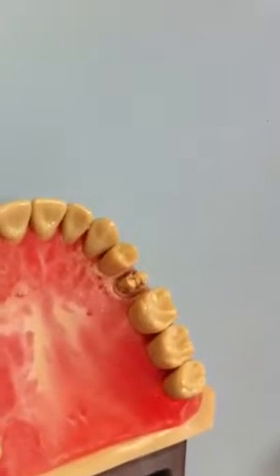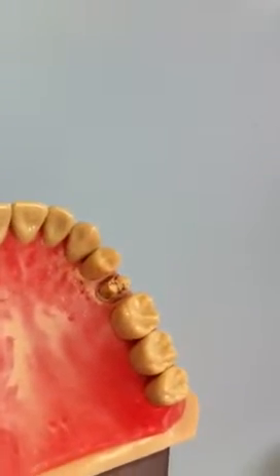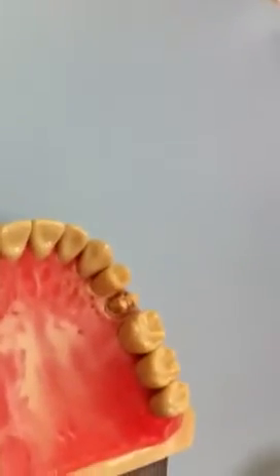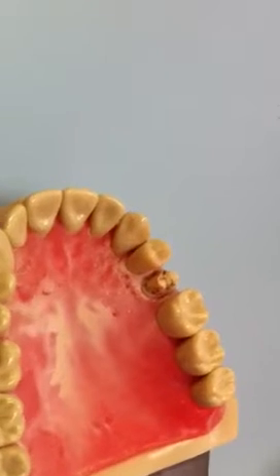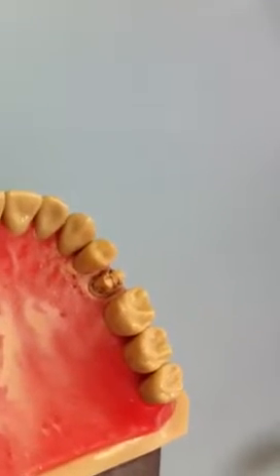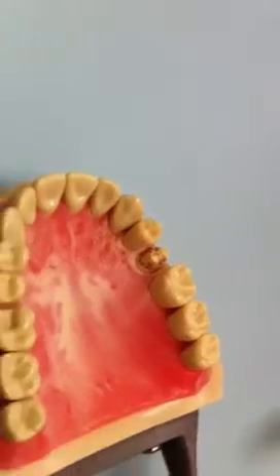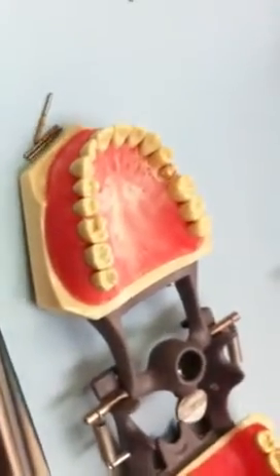We just got done with that prep and we're waiting for the occlusal reduction burr. The occlusal reduction burr is a must for preps due to cutting efficiency, temperature, and so on. That burr is hot — that'll learn me.